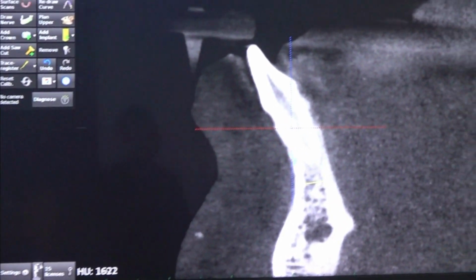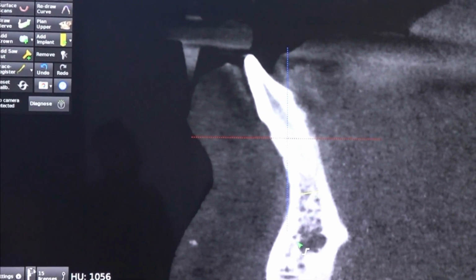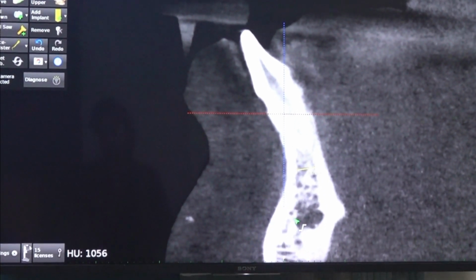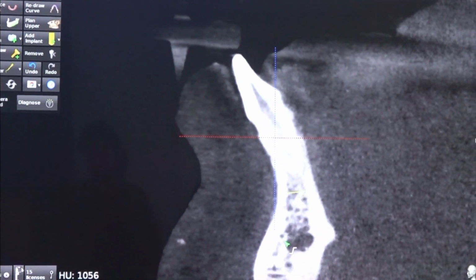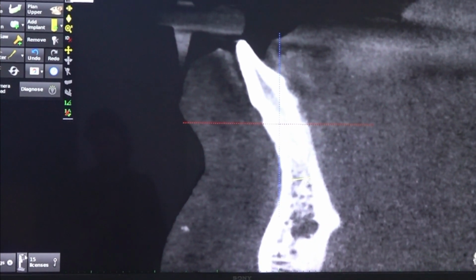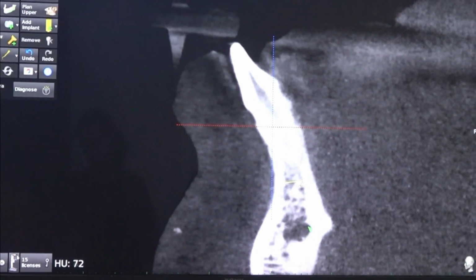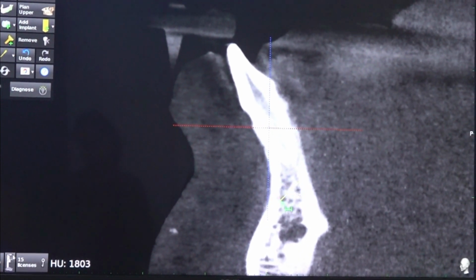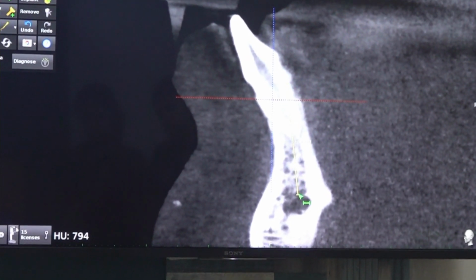One is the labial bone and another is the intramedullary bone quality. So what is the challenging situation? There is no labial bone and the intramedullary bone is also cancellous. There is no labial bone, so you have to choose basal, but the intramedullary bone is cancellous. So this is a tricky situation. But here you can place a basal very comfortably. If you see the black space here, there is no need for the implant to go till here. It is unnecessary, so you can stop short here. This comes to around 17 mm.